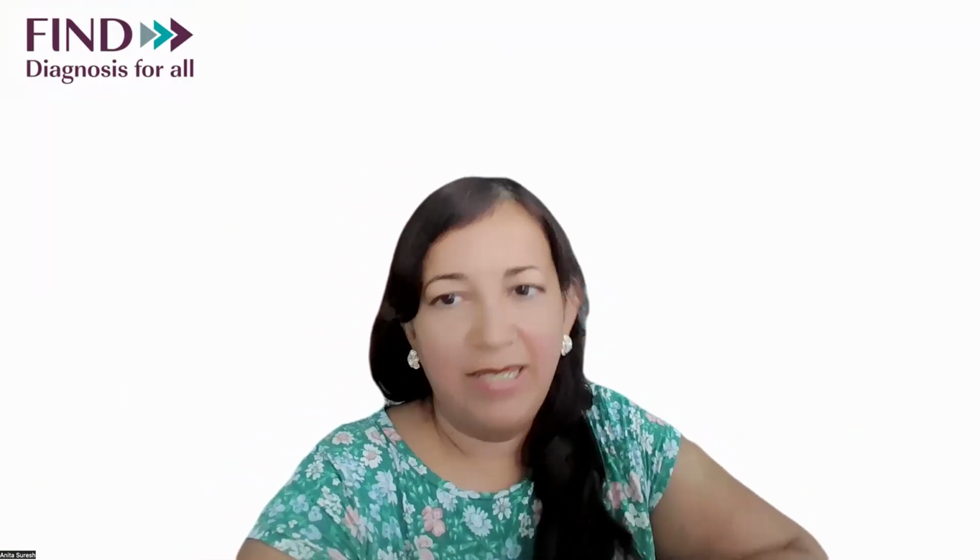Their consideration, so this was for clinical use. I think that's where they saw the value because they were able to get coverage for pretty much all the targets they could act on. So you're right, from an epidemiology standpoint, if they're doing surveillance to understand all the mutations, that makes sense. But for a place like New York, where the volumes are high and they get a diversity of samples, even though resistance is rare, they are going to get a lot of diversity.